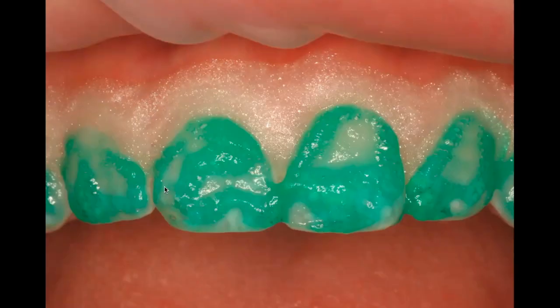So this is a hydrochloric acid etch, right? Normally we use a phosphoric acid, which is less strength. I think hydrochloric acid is maybe like 3 times as strong, something like that. So it's a stronger etch. Essentially this is almost a form of microabrasion. When I was treating a lot of these cases, I would actually use a dry pumice slurry mixed with this etch in order to do microabrasion.